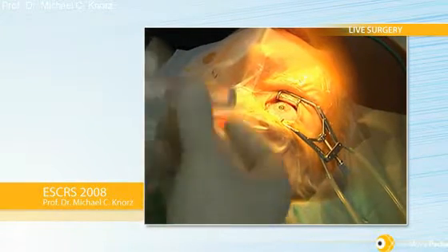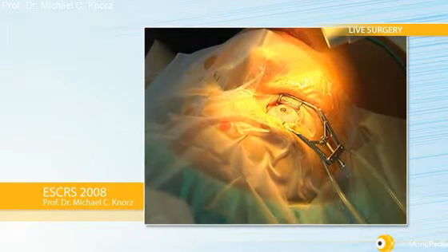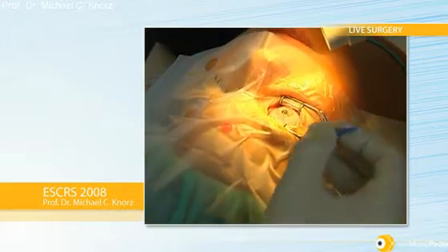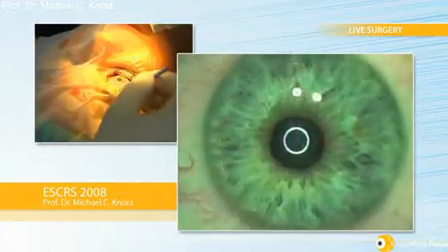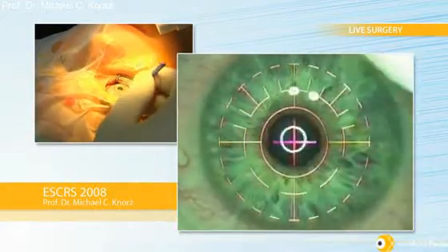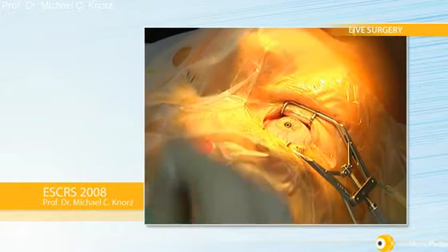Now I wash the eye and do a first-time engagement of the eye-tracking — that's the iris registration — just to make sure I get positive iris registration. Then it's very important to dry the conjunctival sac to avoid a lot of fluid accumulating between the applanation cone of the IFS laser and the cornea. I meticulously dry the conjunctival sac. I got good iris registration here.